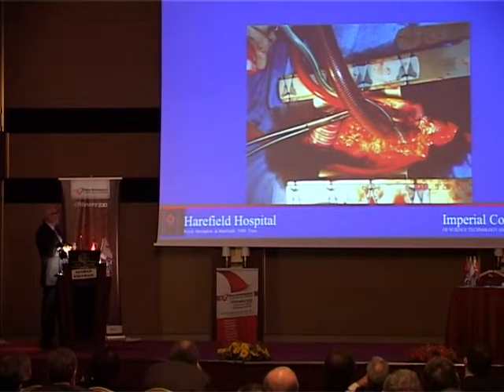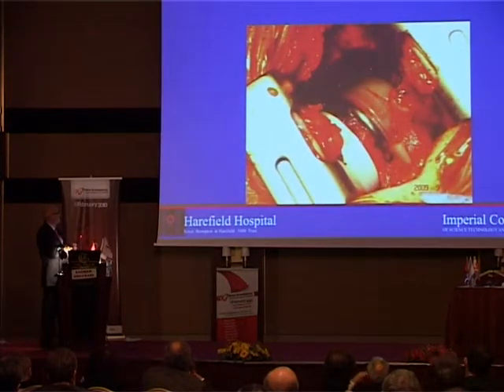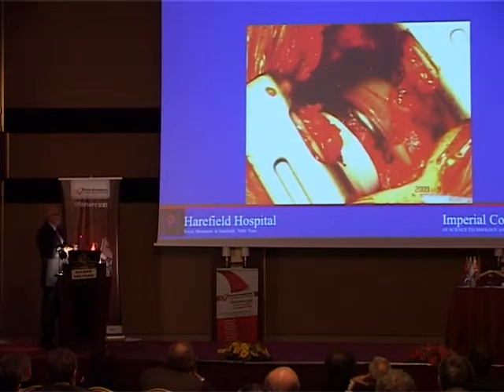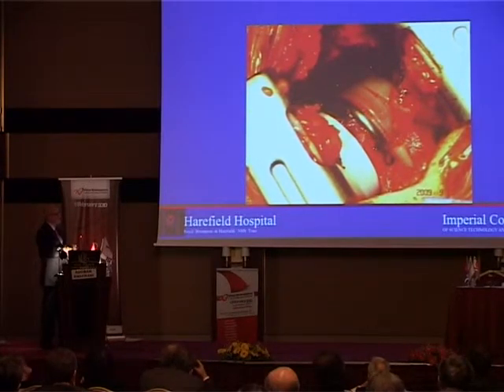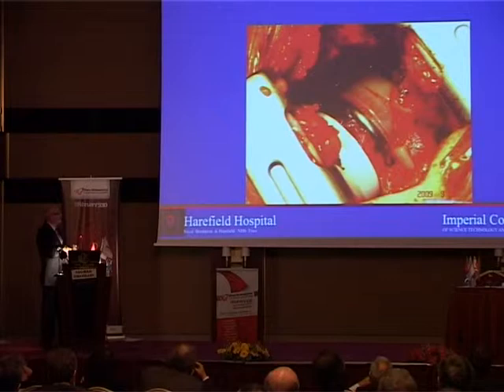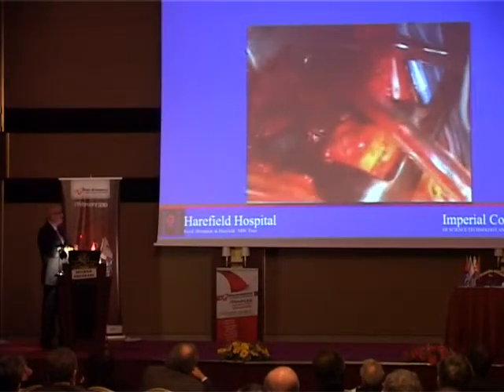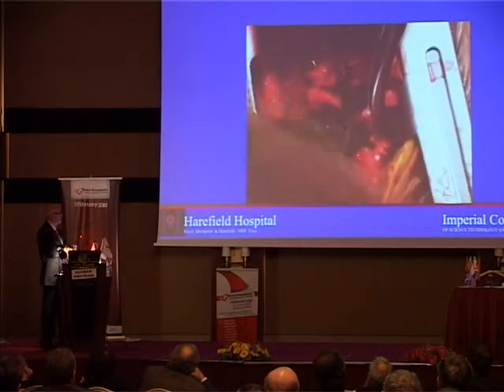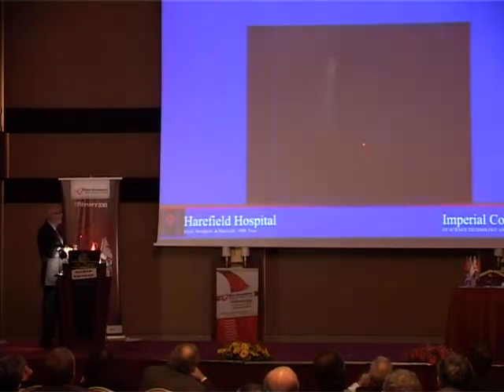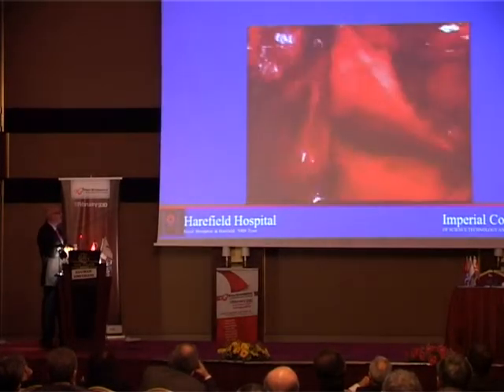If we want not to leave any part of that cuff behind, then we can do that. And then we open the apex and mobilize around the apex through an incision around the 5th and 6th intercostal space. Sometimes 5th as well as 6th under this skin, because you want to get to the lower part of the cuff, to this area, to cut it and pull it out.